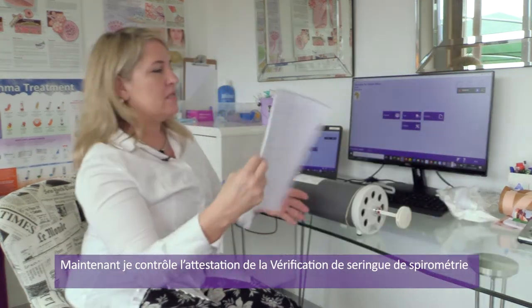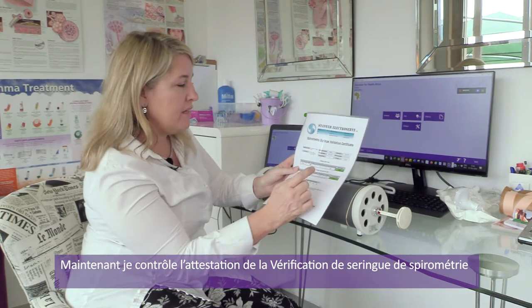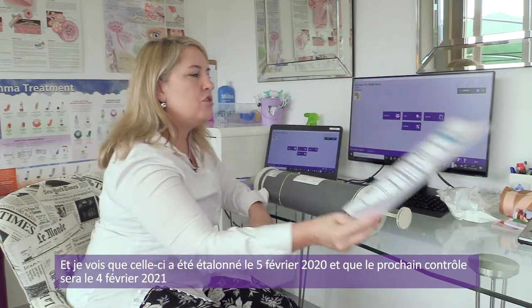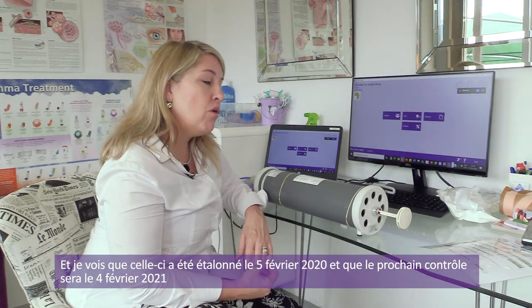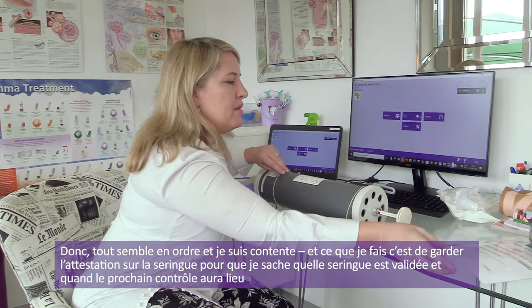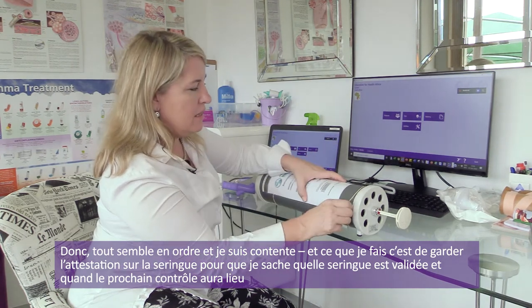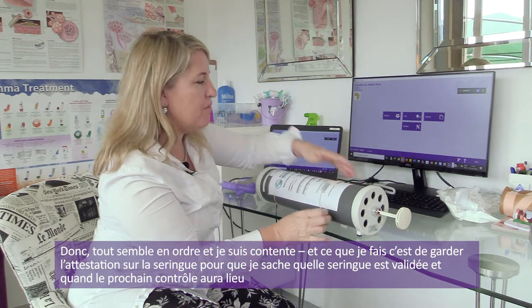The next thing I do is check my spirometry syringe validation certificate. I can see that this one was calibrated on the 5th of February 2020, and it's due to be calibrated again on the 4th of February 2021. I actually keep my certificate on the syringe so that I know which syringe is validated and when it needs to be revalidated.